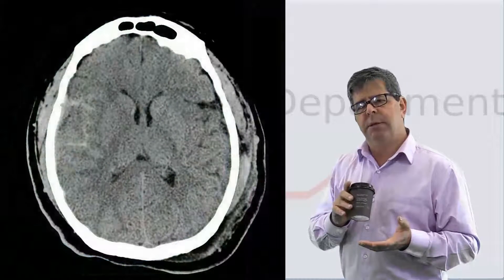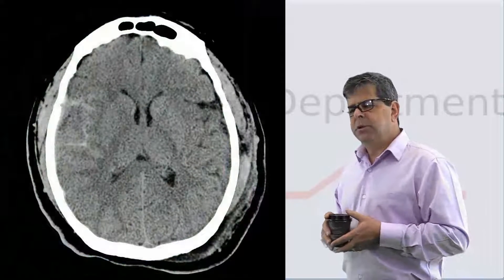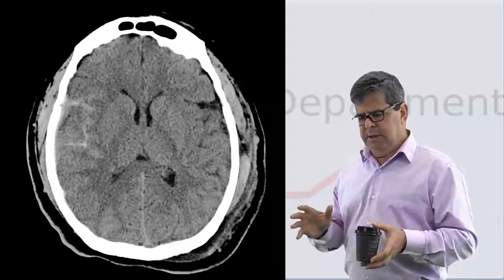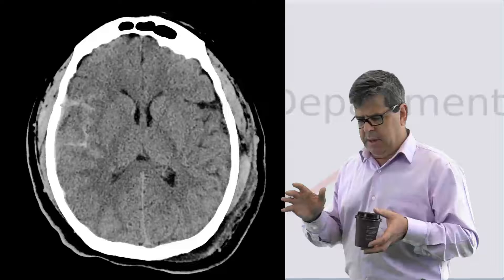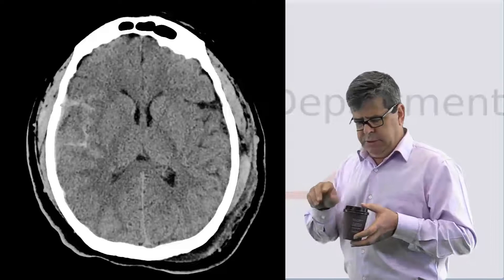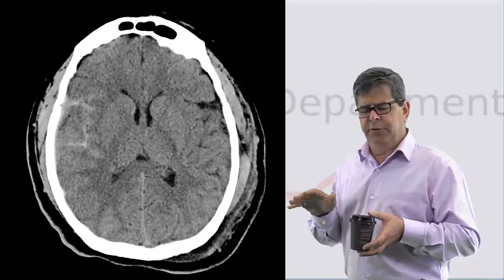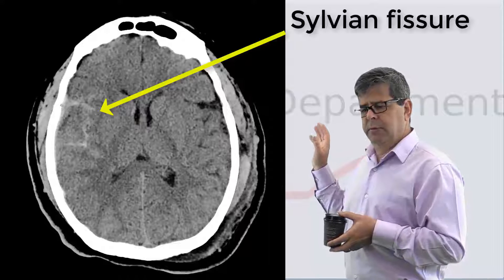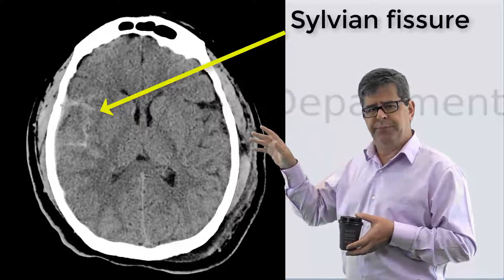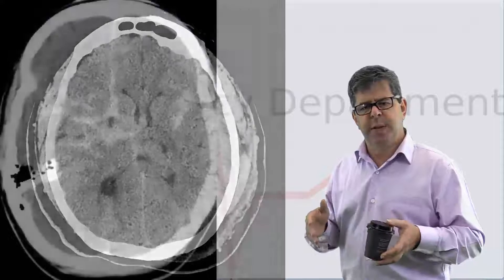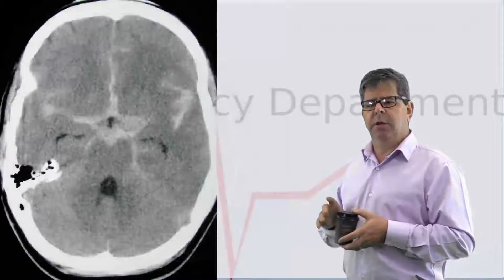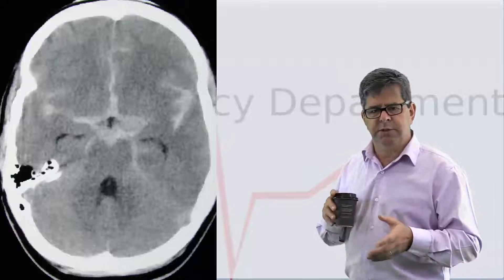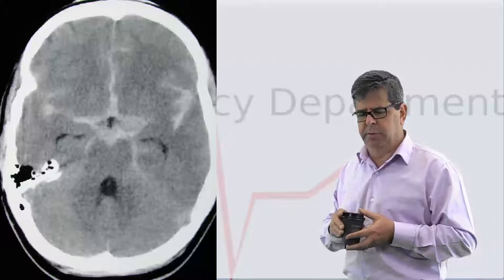Next, we should think about traumatic subarachnoids. Like non-traumatic subarachnoids, the best places to look are the CSF-filled cisterns and the sylvian fissure — comparing one side to the other. These CSF spaces are usually black, but with acute blood they'll become white, and therefore can be relatively easy to see if you know what you're looking for.